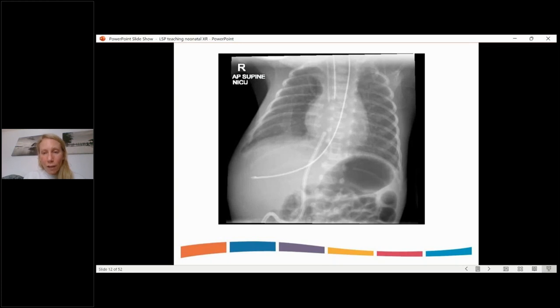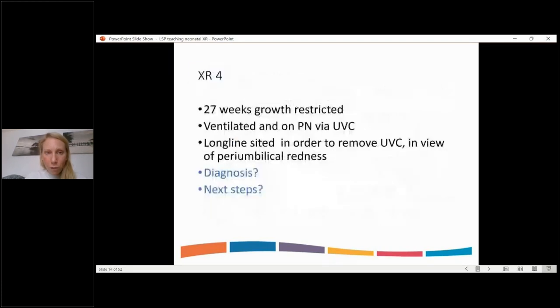So just remember as well that they may be at risk of having increasing abdominal distension, which may compromise their ventilation, because you're unable to aspirate the stomach for the time that they're not allowed an NG tube. Well done with that one.